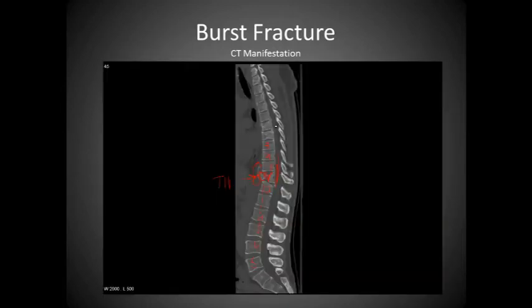And the reason we can discern this is because looking at the inferior surface, notice how there is an area that is raised on it, and we have a wedge-shaped pattern here for T6. And so because of that, we can kind of feel safe in assuming that there's other fractures as well. But most severe is this one.